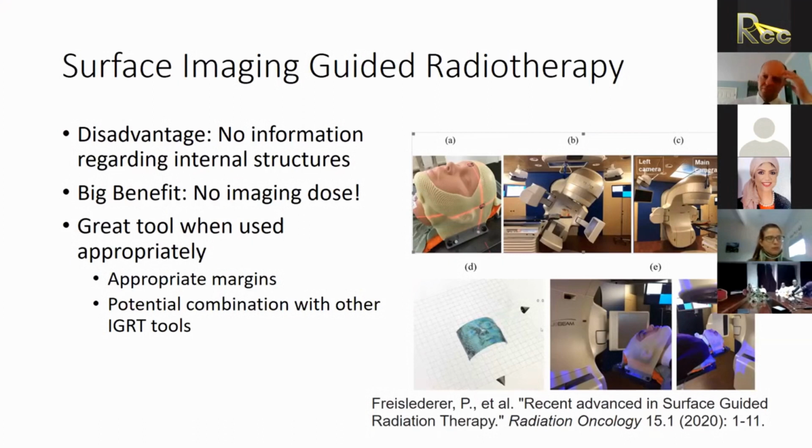We have just one single question from Zahra. This is the last one. She asked about the mask that is shown in the slide about the surface imaging. She asked why the face is exposed. It's not covered. I think this is a double layer mask. It's a double layer mask, so it's very thick, and it's for more sophisticated and more conformal techniques.